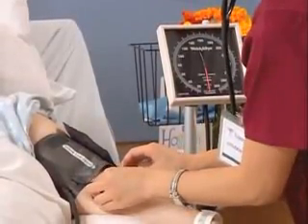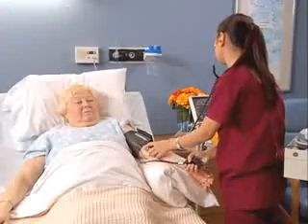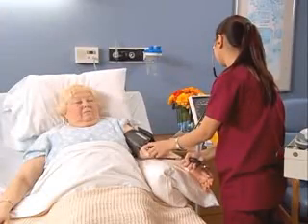Finally, you'll take the patient's blood pressure. BP is measured in millimeters of mercury and is recorded as a fraction. Systolic pressure over diastolic pressure. It is typically measured at the brachial artery site using a stethoscope and a sphygmomanometer.